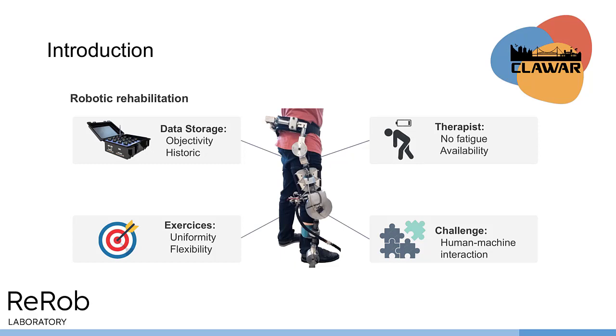During the movements executed by the robot, it is important to ensure the welfare of the patient and safe operation, avoiding damage to these components. In conclusion, the success of therapy sessions depends on a comprehensive evaluation of the human-robot interaction before implementing assistive robotic therapy.